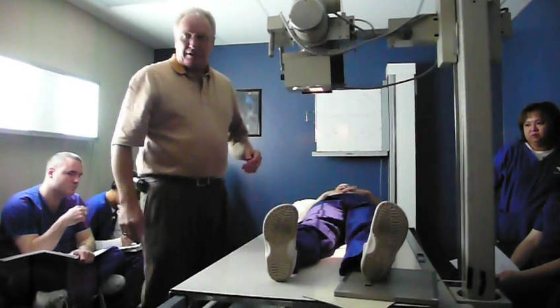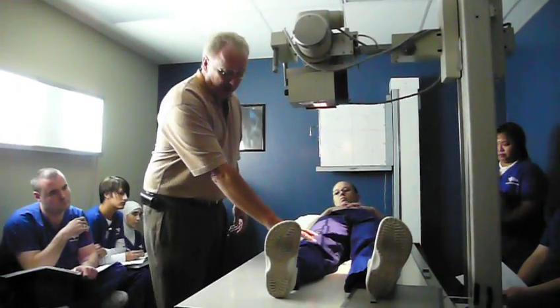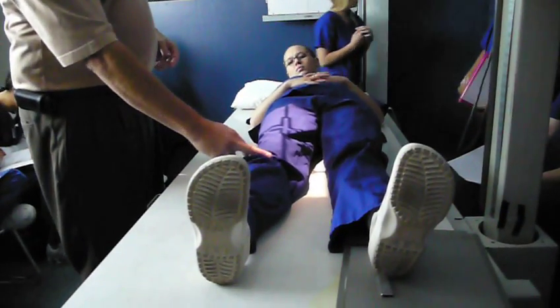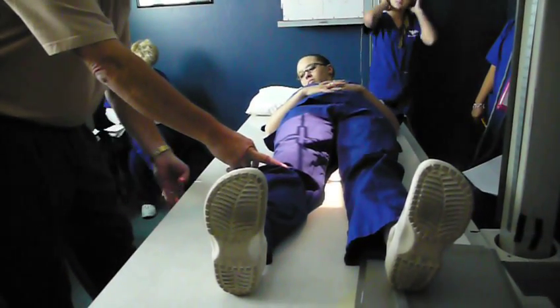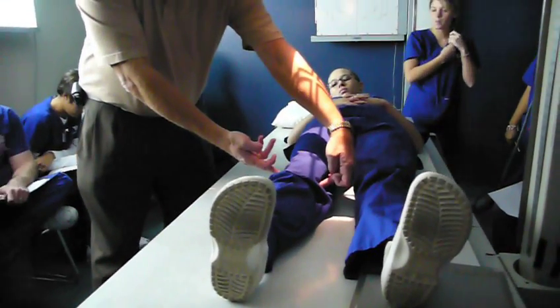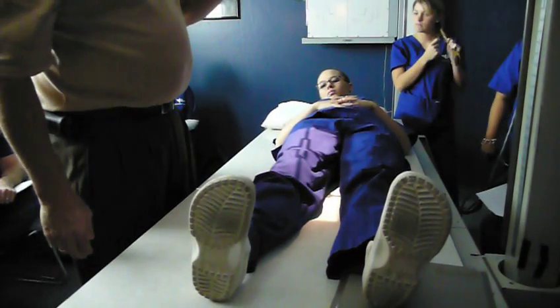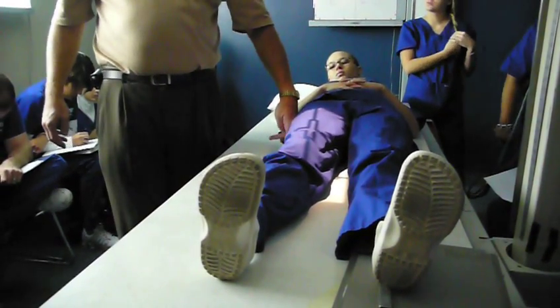Okay, distal femur. Feel for my knee, and I set my IR for 17 inches. I'm an inch and a half to two inches below the knee. Line up my IR — what I want — I have a condyle parallel. I've collimated down as much as I can.